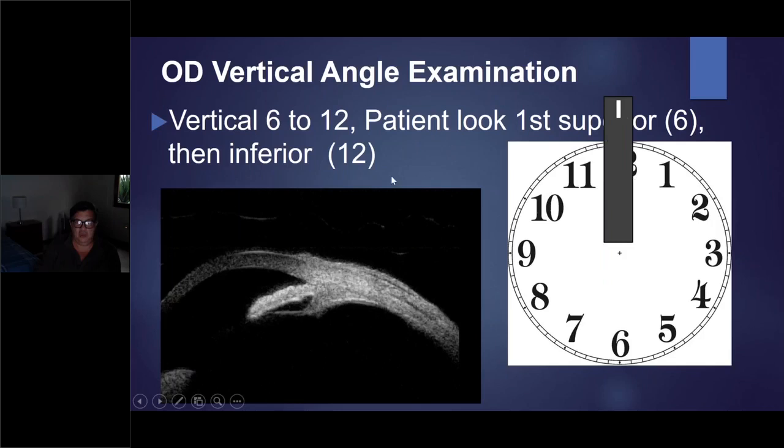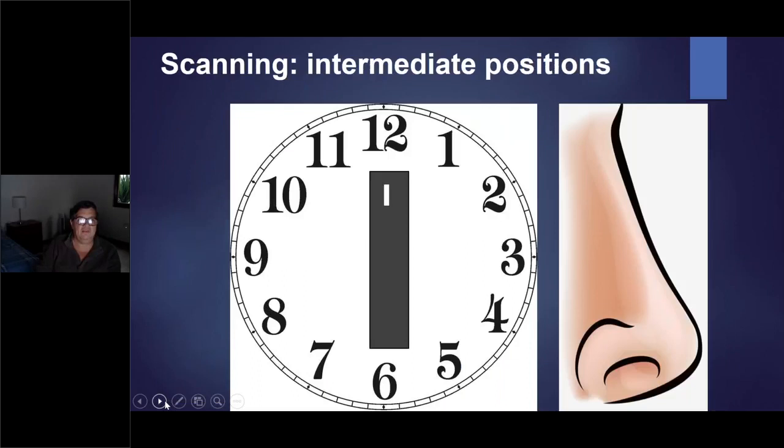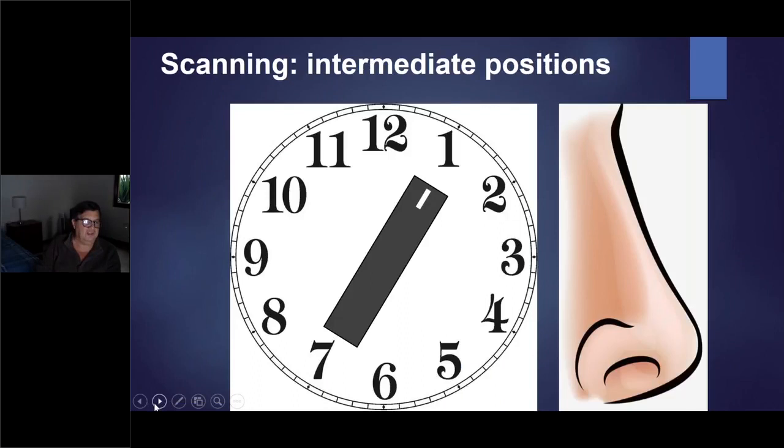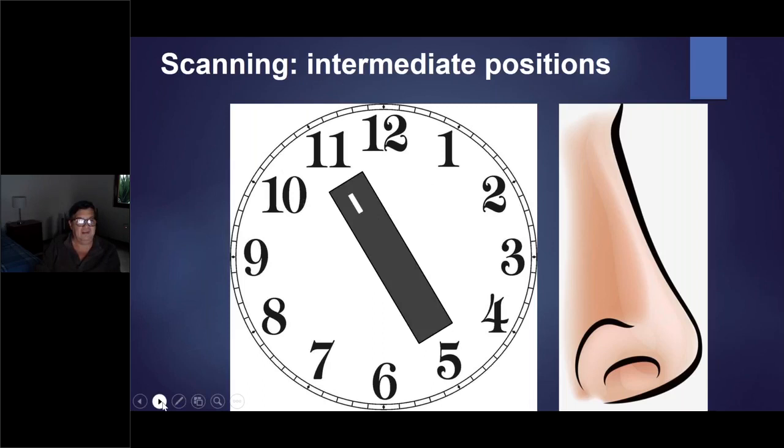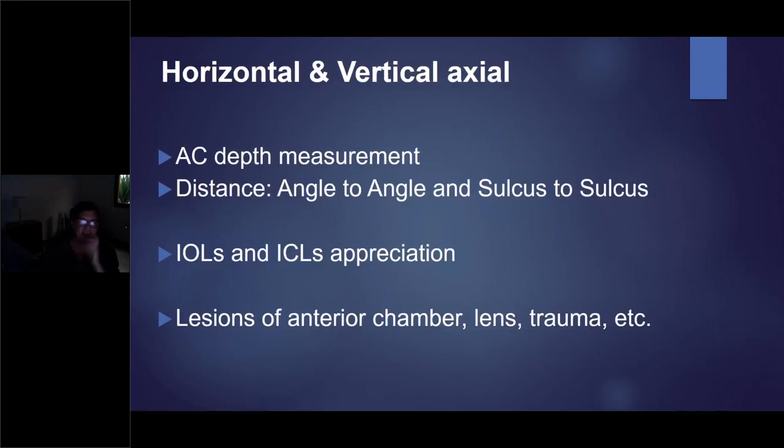I make the same examination using the same principles when I make all the intermediate positions, always facing this mark up or nasal. We will see. When I go down, I don't go down, I put my marker up. And then again and again. Then, when I look to the right side of my image, I know exactly where I am.